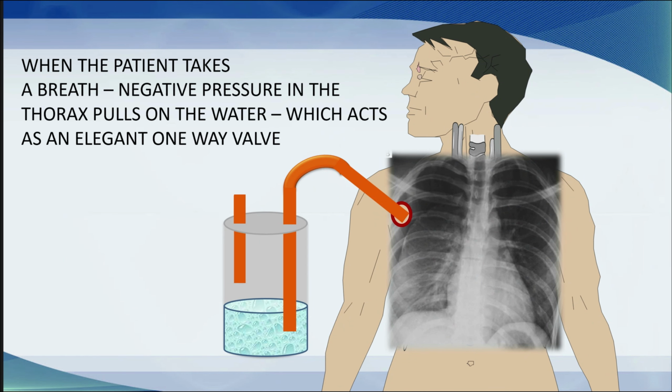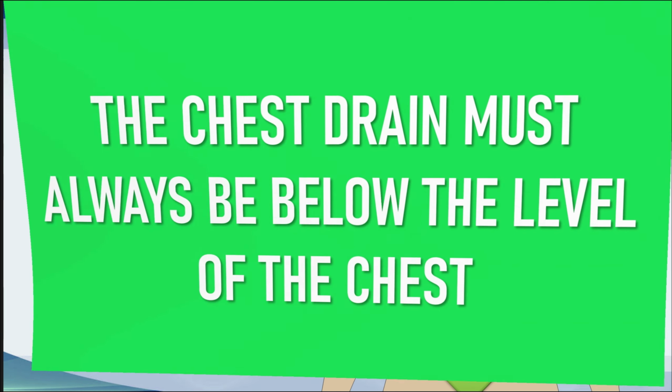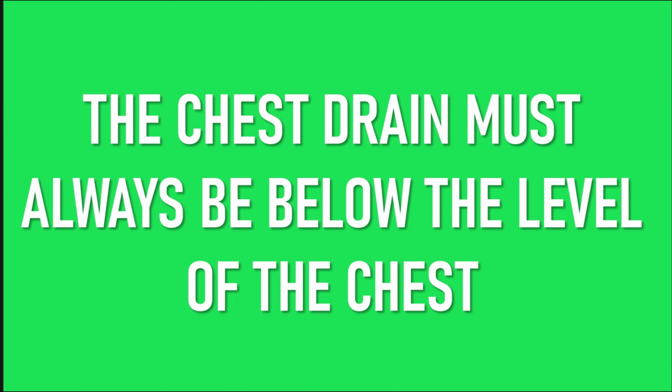When the patient takes a breath in, the negative pressure within the thorax pulls on the water, and that acts as an elegant one-way valve. Now, the key thing you need to understand, of course, is that the chest drain must always be below the level of the chest.